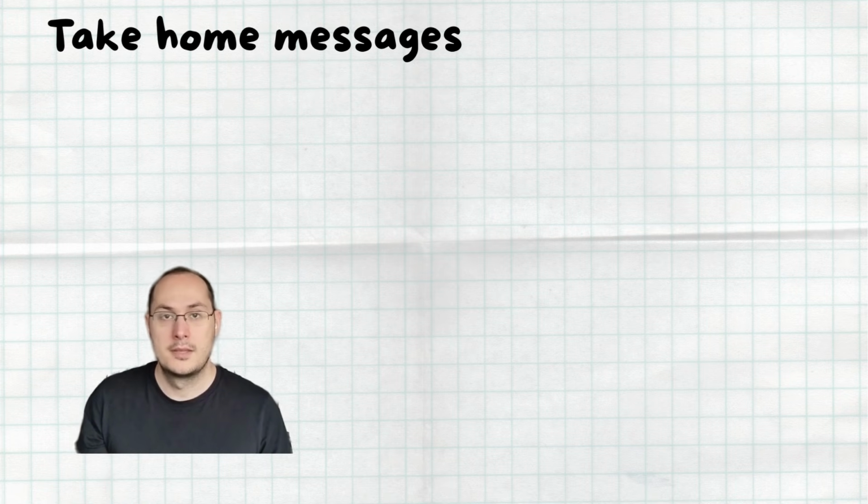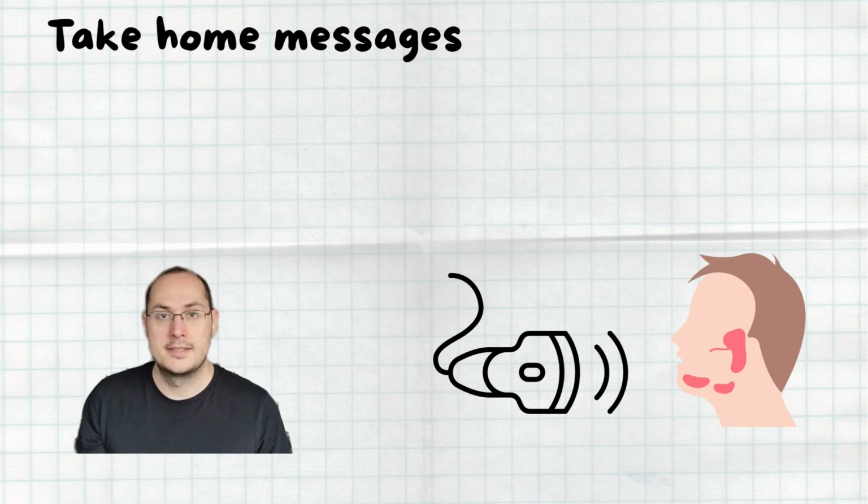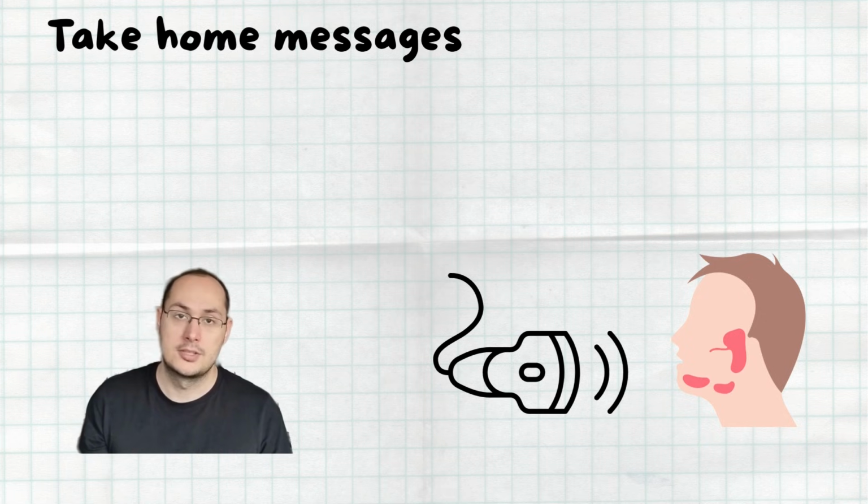As you can see, salivary gland ultrasound is definitely a useful and accessible tool. It provides lots of information regarding the structural changes of salivary glands. Although there are certain limitations regarding its use in follow-up, we could expect it to be an addition to the classification criteria in the future.